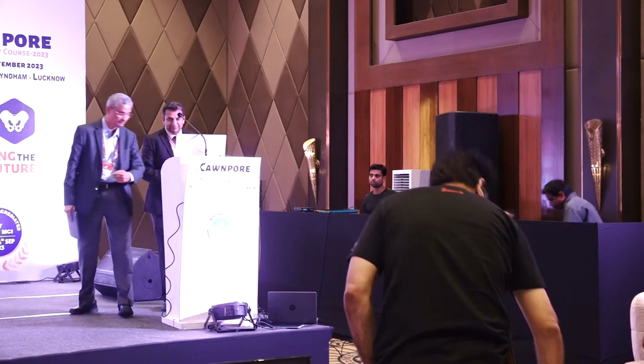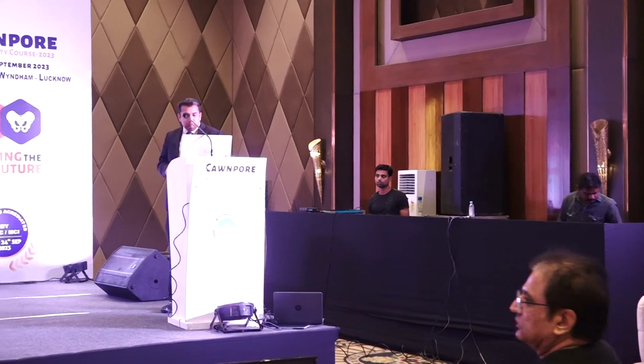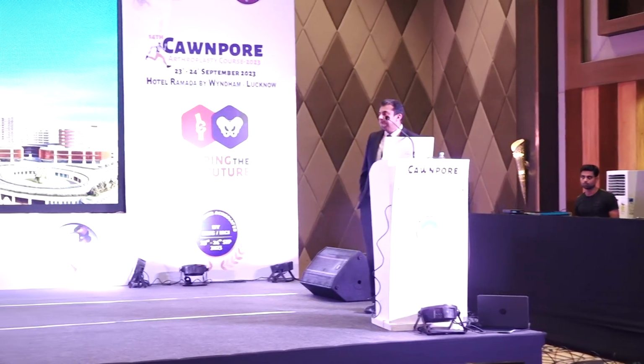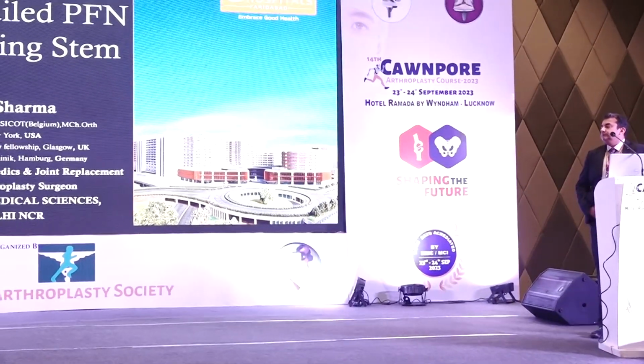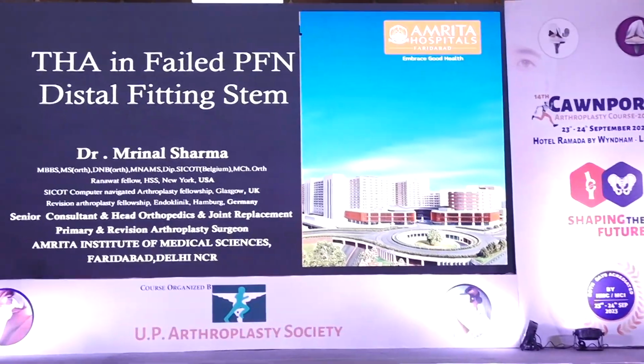Right. So, very good question, Mrinal. I should thank you for this. For revision scenarios, it's a very good technique. The distraction technique was first given to us by Paprosky and used many times for revisions. What you do is basically you distract the whole pelvis, put one size cup above it, and then you leave the distraction and you feel that the whole thing will collapse.